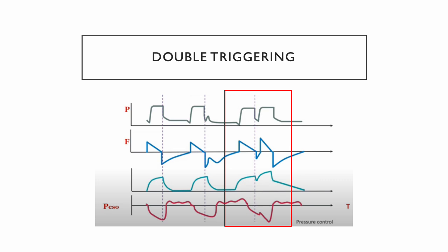It happens in AC-PC because the mechanical inspiratory time is too short, i.e. we set the TI too low. In AC-VC, it may also result because of flow starvation, where flow starvation may actually trigger another breath, and it usually occurs because tidal volumes are much lower than what the patient wants.